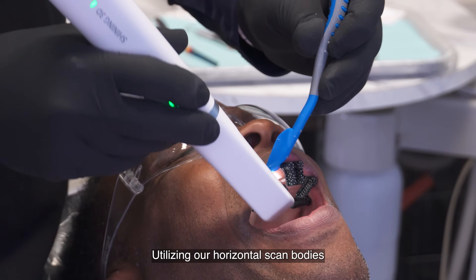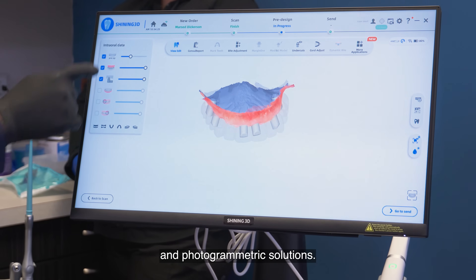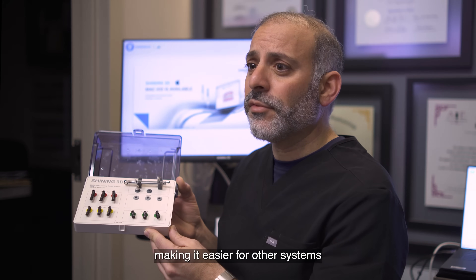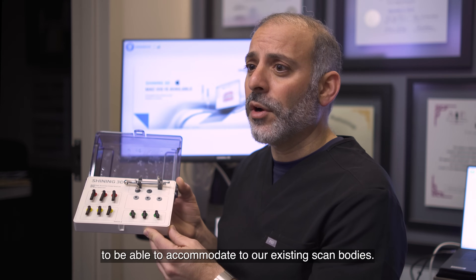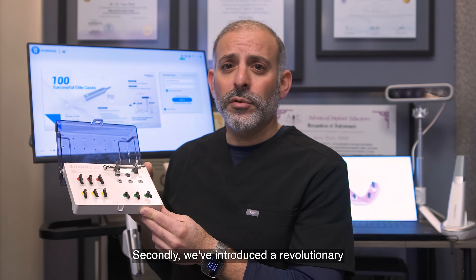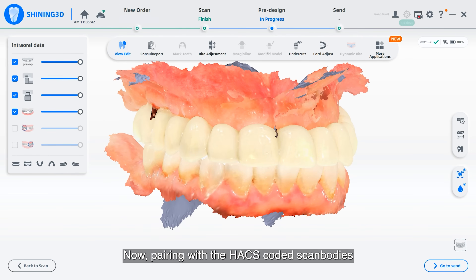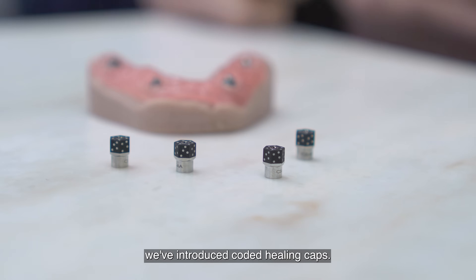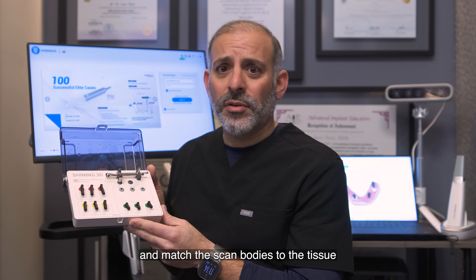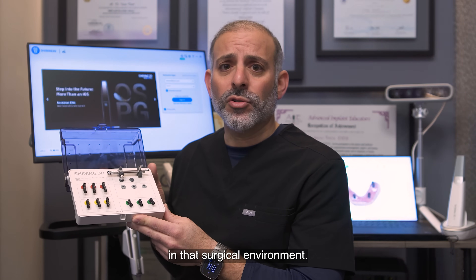Utilizing our horizontal scan bodies that will act as both intraoral scan bodies and photogrammetric solutions, we've taken it a step further. First, we've removed the screw, making it easier for other systems to accommodate our existing scan bodies. Secondly, we've introduced a revolutionary new technology within our software. Now pairing with the HACS coded scan bodies, we've introduced coded healing caps. Very often, trying to capture and match the HACS scan bodies to the tissue becomes quite problematic in a bloody field in that surgical environment.